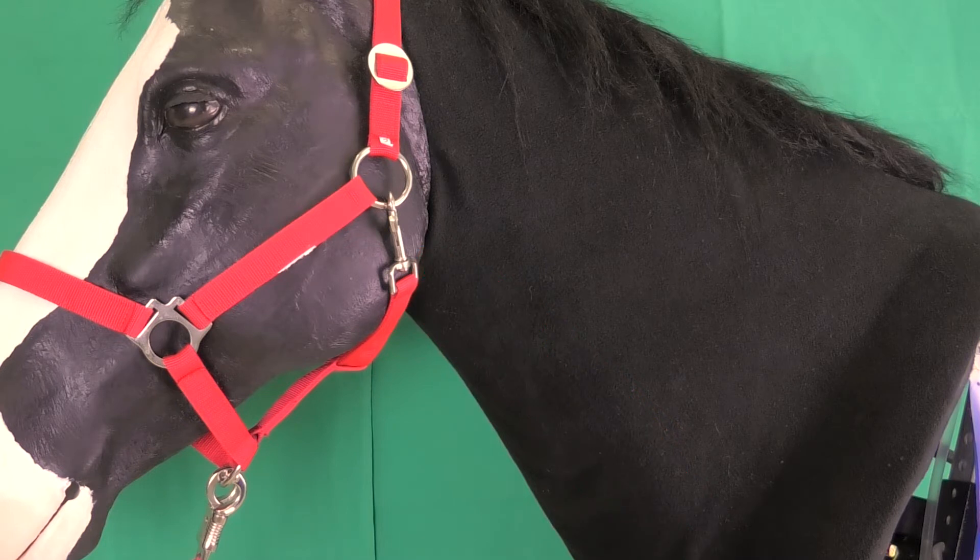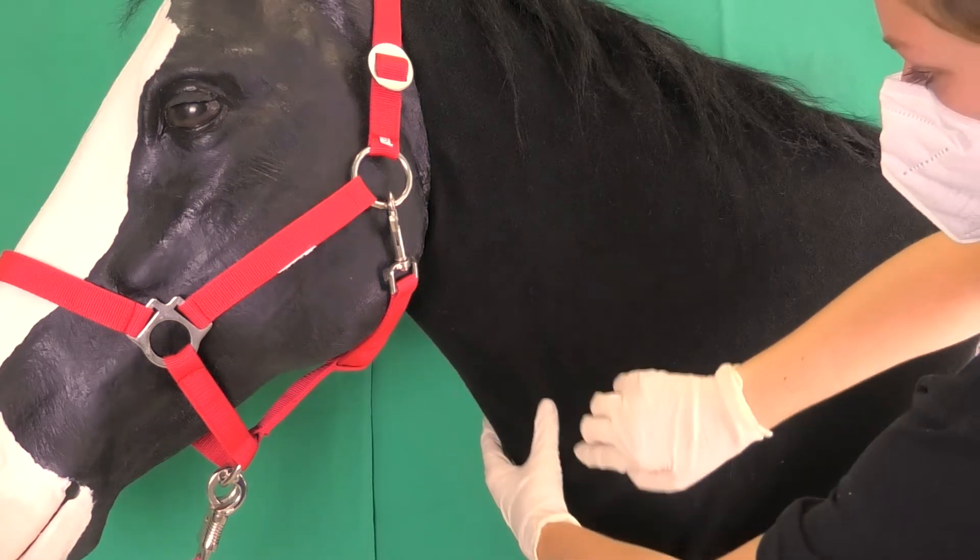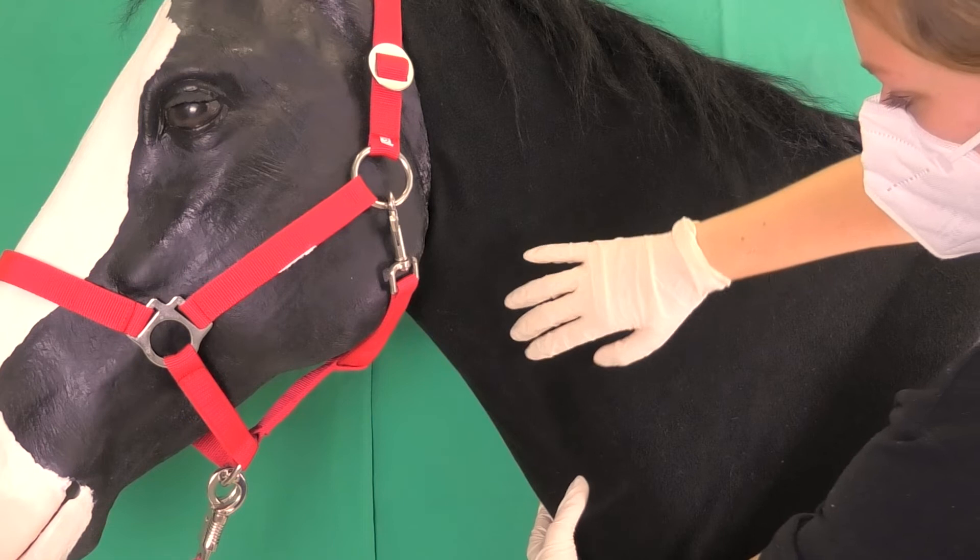In horses with strong lower neck muscles or thick winter fur, the vein can be difficult to locate and therefore also to congest. In this case, shearing the fur can help expose the vein better.